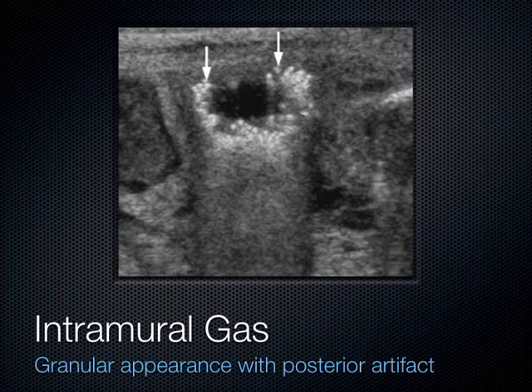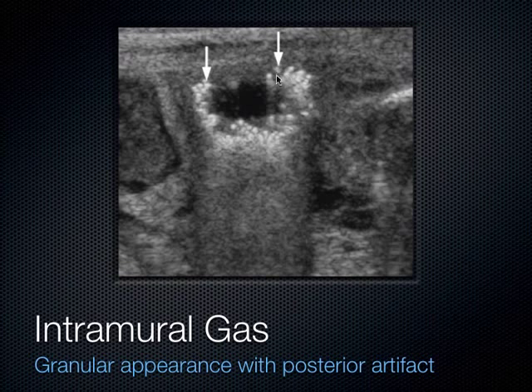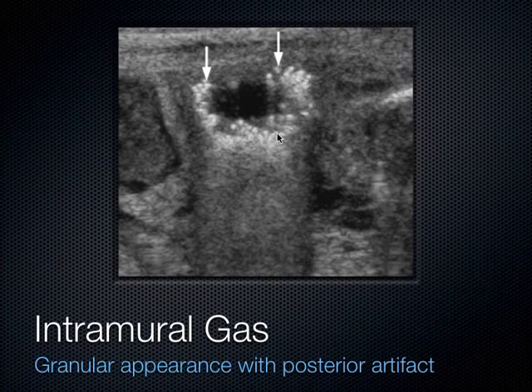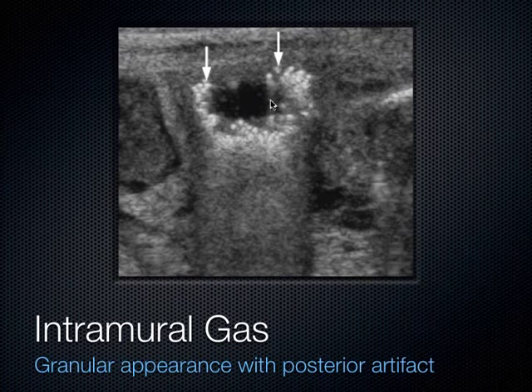This is what it looks like when you have air in the wall of the bowel — a very sick bowel. This is what it looks like with necrotizing enterocolitis: you get intramural air that looks like little punctate areas. Sometimes we can see comet tails — a reverberation artifact that goes toward the bottom of the screen. You see that with air and sometimes metal, but air classically causes these comet tails.